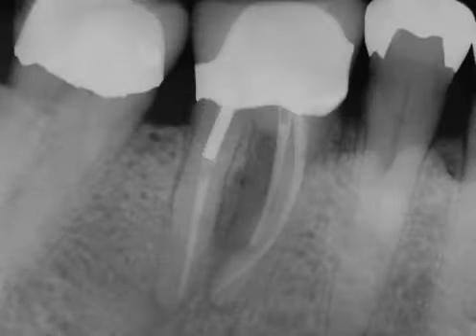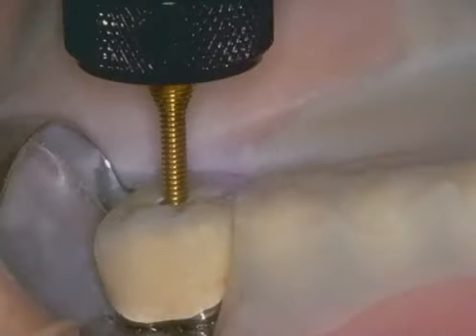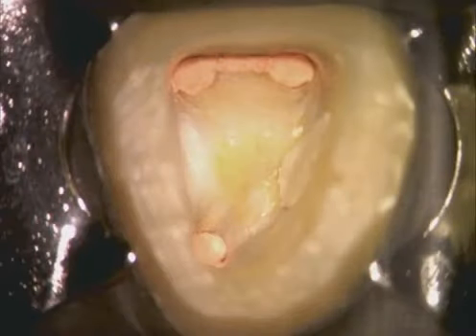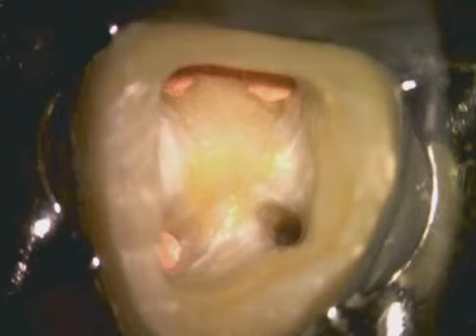Here's a mandibular first molar that demonstrates multiple retreatment challenges. The metal lift can be used to remove the porcelain-fused-to-metal crown. With the crown off, notice the metal lift and how it mechanically removed the crown. With great access and improved visibility into the pulp chamber, notice that the distal buccal system is not centered within the pulpal floor. Access is corrected.